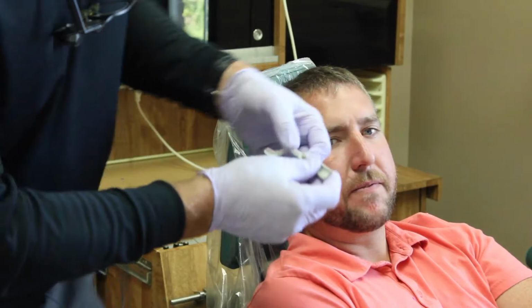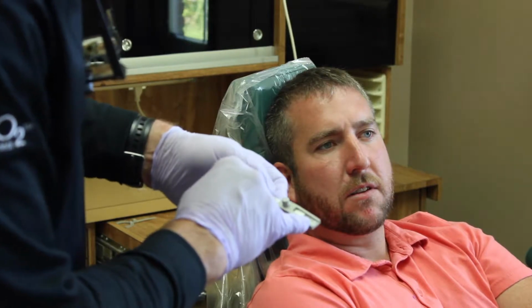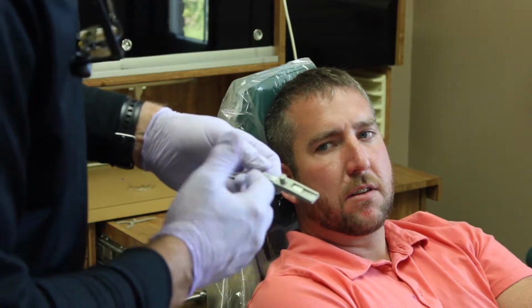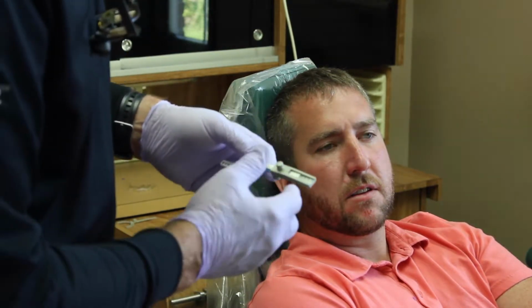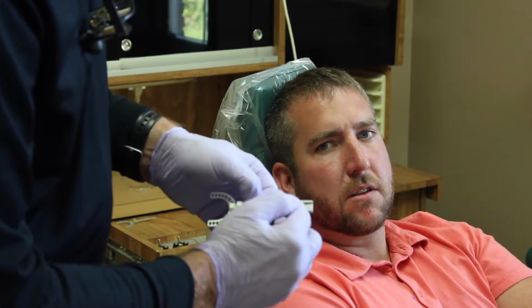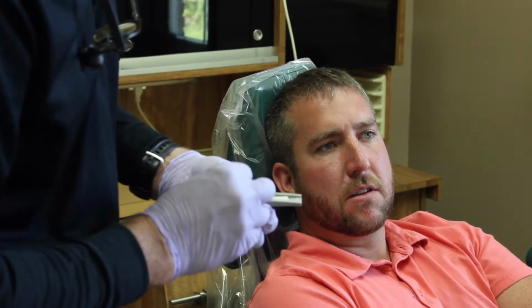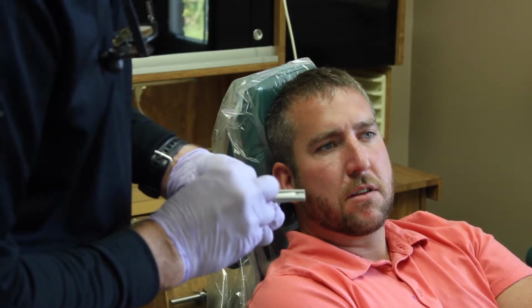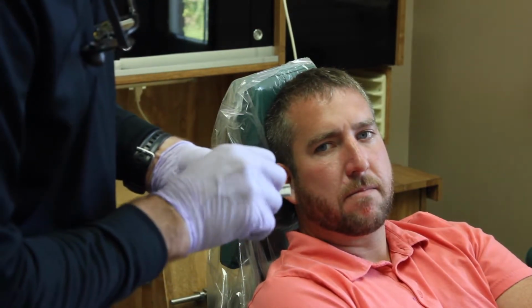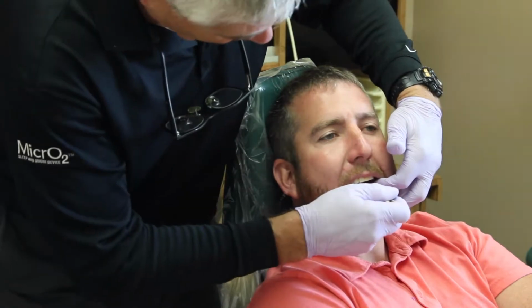And open. So when we take a look at Jeff's range of motion, he goes from a positive, right around 6 millimeters, to a minus 5 millimeters. He's got about an 11 millimeter range of motion. So I might want to start him at about 60% of that range. If here's his normal position, he's protruded all the way, I might want 6.6 millimeters, or almost 7 millimeters, of that range of motion. So I simply loosen the screw, come forward, and count off 1, 2, 3, 4, 5, 6, 7 millimeters into that range of motion. That's 6.6, I'm rounding it up to 7. And that's going to be where I want him to place his mandible when I take his bite.